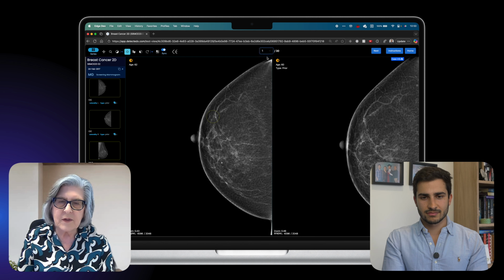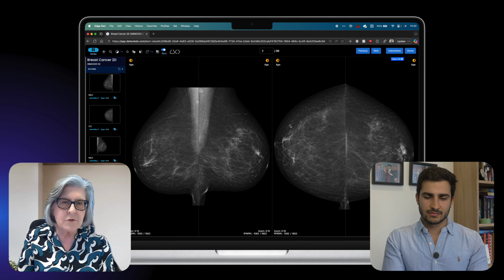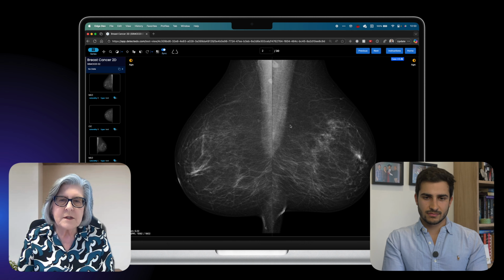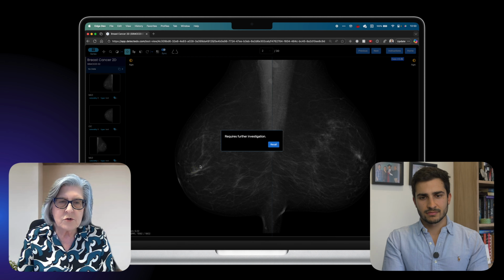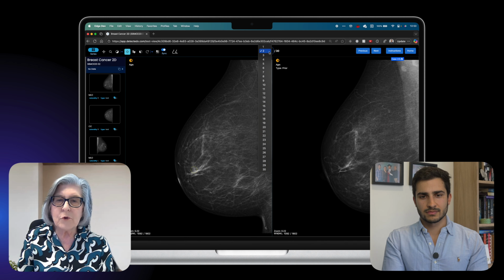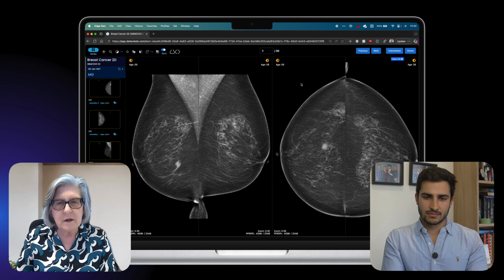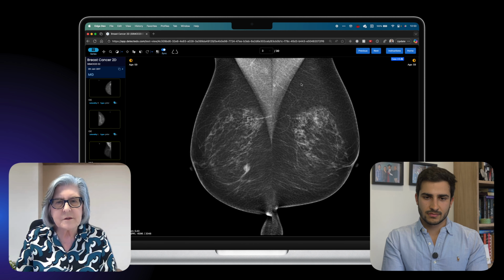And the big advantage, of course, is that we have a cancer-enriched test set, for example. The user, once they've seen their score, can go back and review each individual case with the truths marked, and all cases of pathology truth are proven. So this allows people to review and learn from that review process.